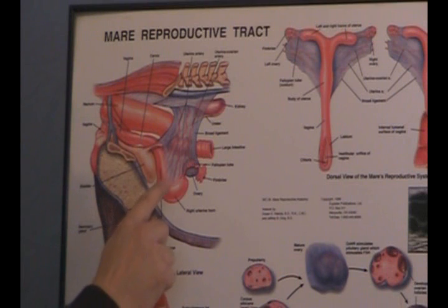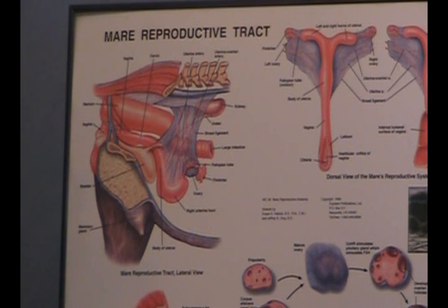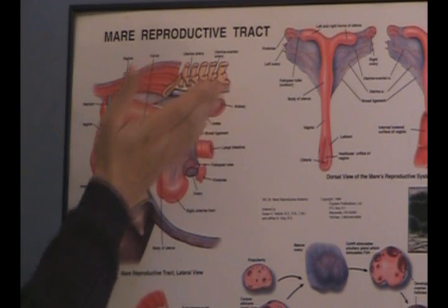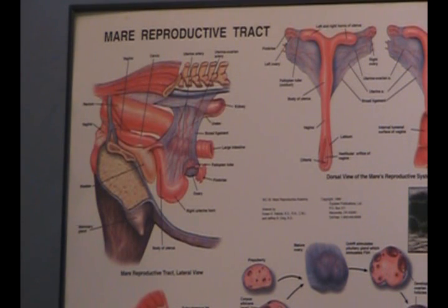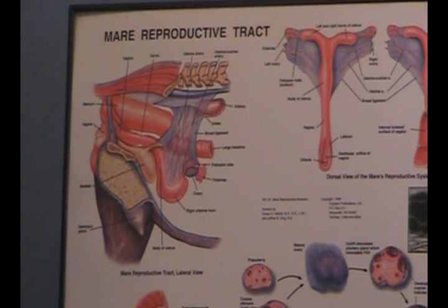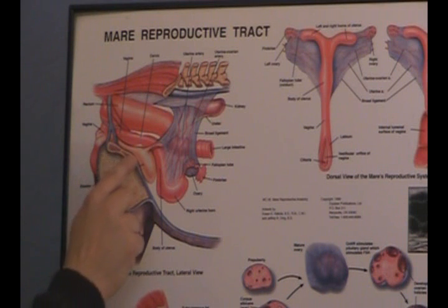The entire reproductive tract sits on top of the digestive system, which for purposes of this diagram has been removed, but when present, elevates the entire reproductive tract up near the spine so that the horns are located near the rectum. The ovaries are actually located near the kidney or at the point of the hip near the hollow of the loin.